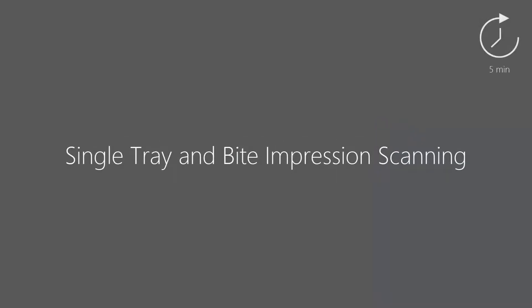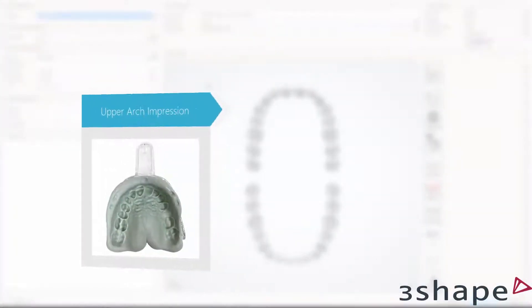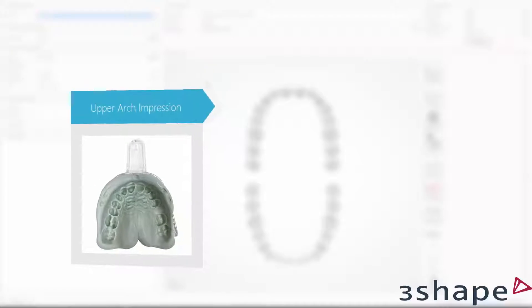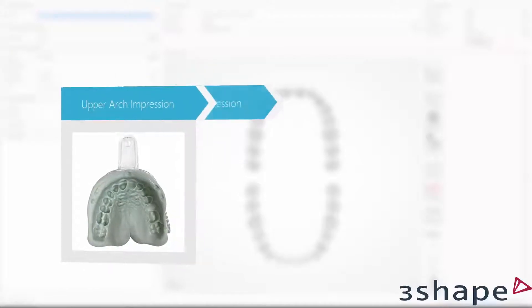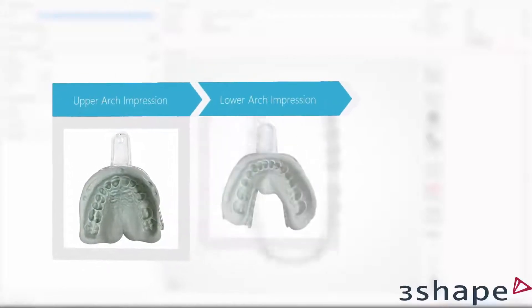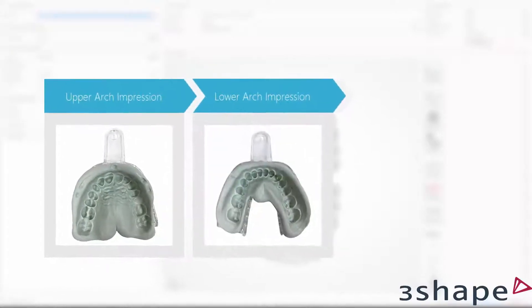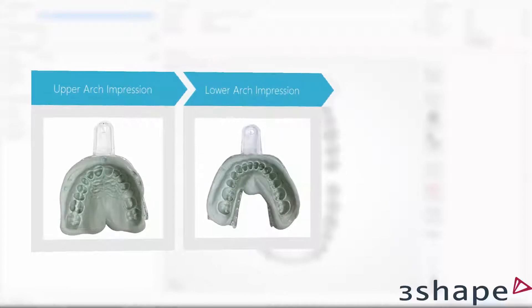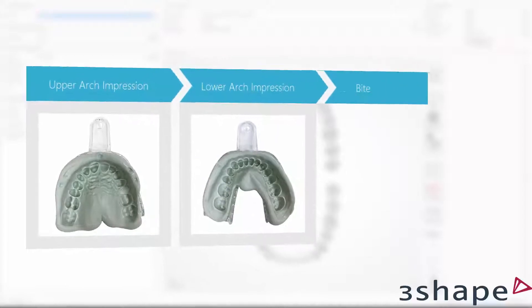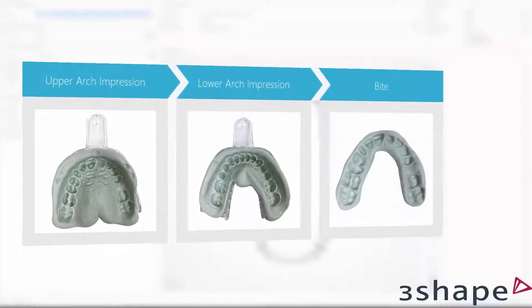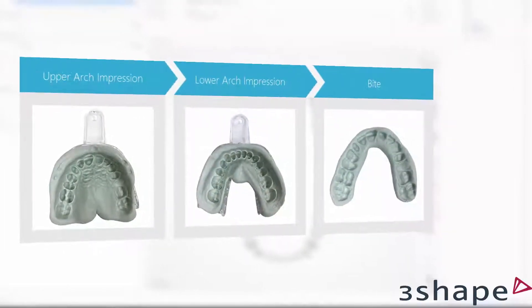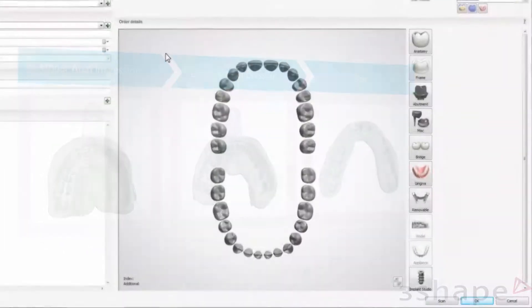Watching this video you will learn how to scan a single-tray impression with a bite. This type of workflow may be useful for model-less full anatomy crown production. It will save your time and resources on model production, and it allows dentists who are not yet Trios users to join model-less digital production.